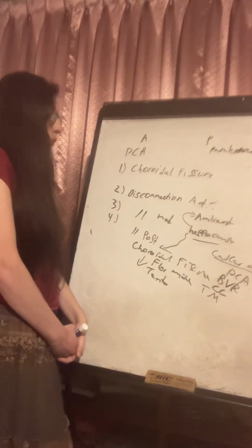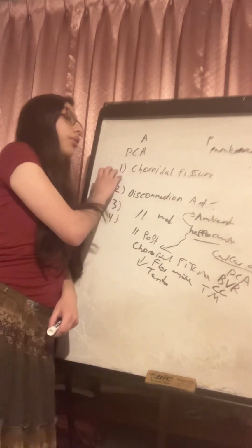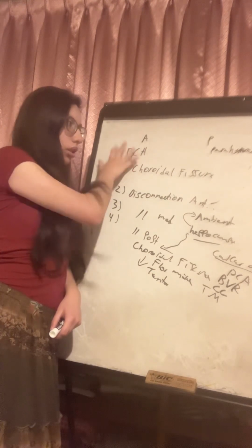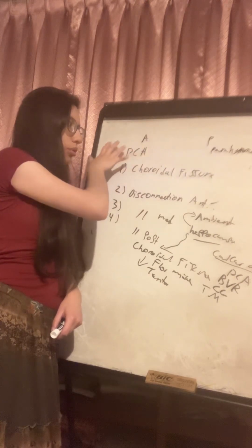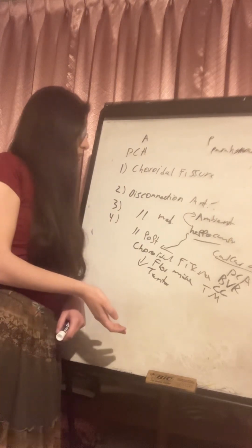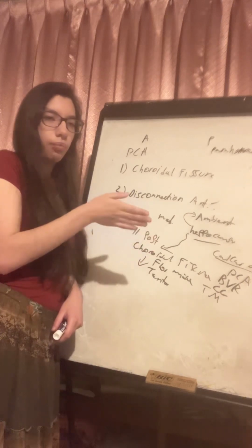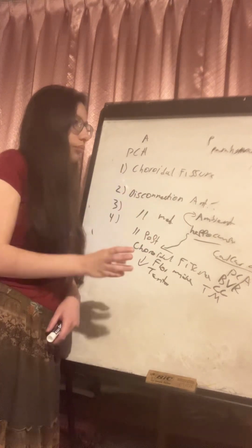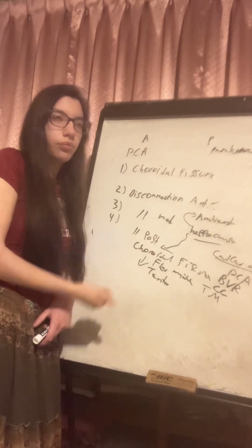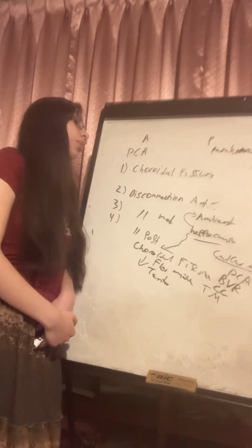So in the hippocampectomy, in a mesial temporal lobe epilepsy, we first open the choroidal fissure, incising the taenia fimbriae. We have an anterior and posterior portion. In the anterior portion we see the posterior cerebral artery. In the posterior portion we see the parahippocampal gyrus. The choroidal fissure is reached by following the choroid plexus in the temporal horn, and the choroidal fissure will mark the beginning of the hippocampal body, and a little bit more posteriorly the tail of the hippocampus.